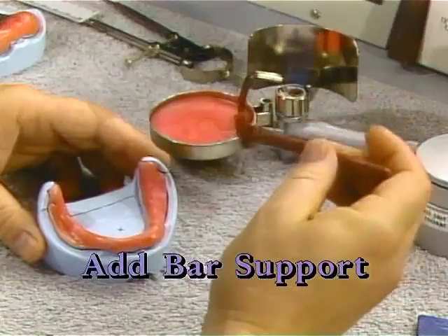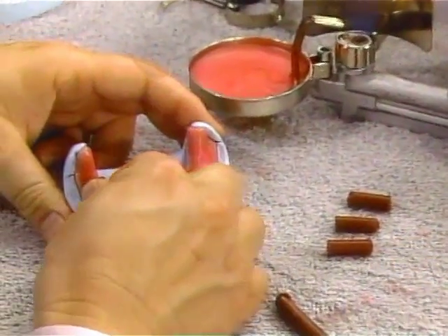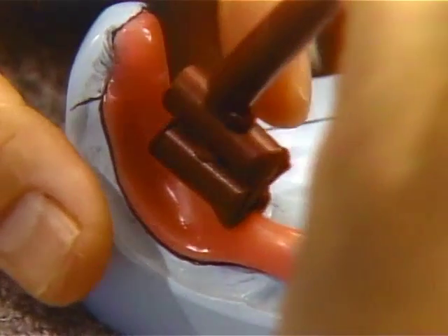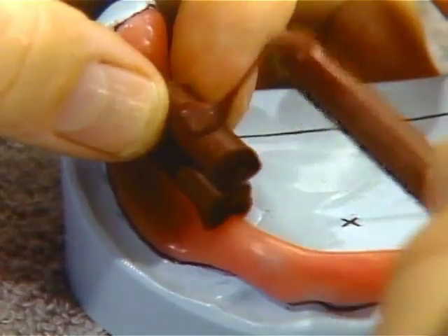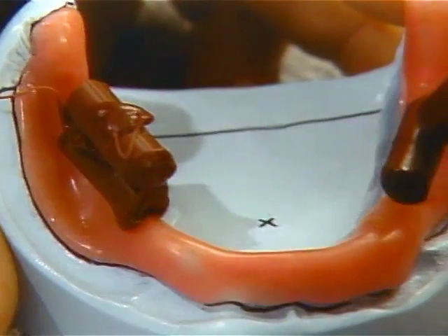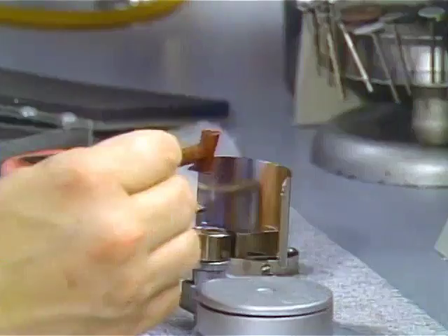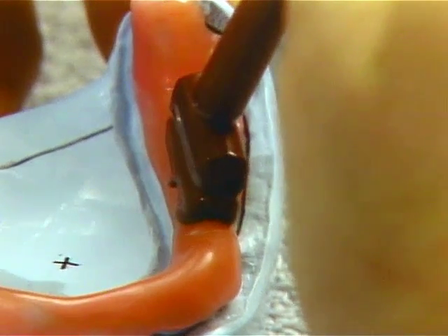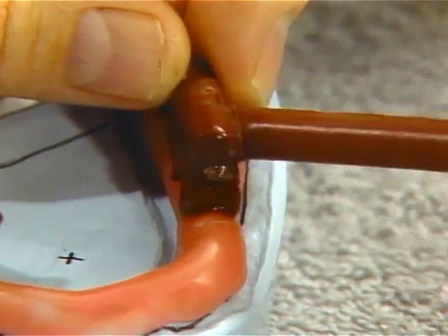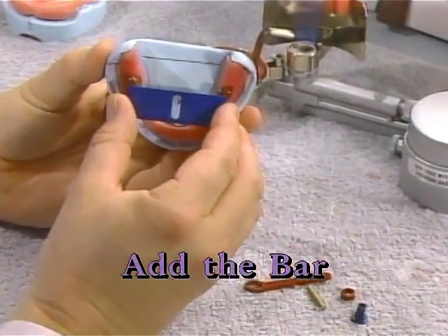Place a roll of soft stick compound on the ridge from about the cuspid region to the second molar region. If necessary, place another roll on top of that, so the top of the roll is higher than the bottom of the retromolar pad. Do the same on the other side. Put the blue bar on the compound with the slot in the bar centered on the X on the floor of the cast.